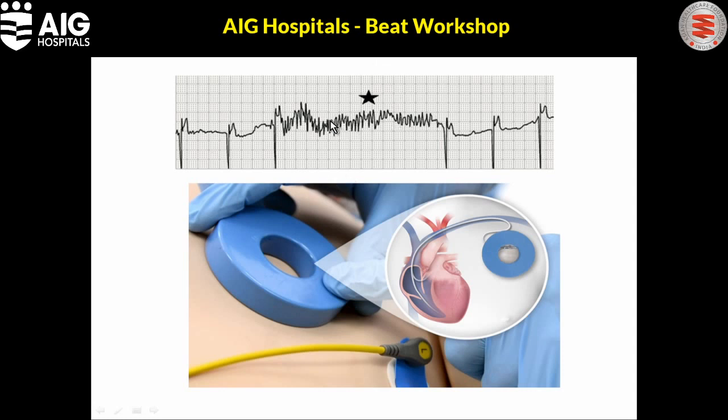So what is happening to this pacemaker is that it is oversensing these non-physiological signals due to the electrical signals of the cautery, and it has stopped its pacing function. This will lead to syncope and whatnot in a surgical theater. So how do we tackle this? A very simple way to tackle this problem is to place a magnet over the pacemaker battery. What happens when we keep a magnet over the pacemaker battery? We literally close the eyes of the pacemaker.